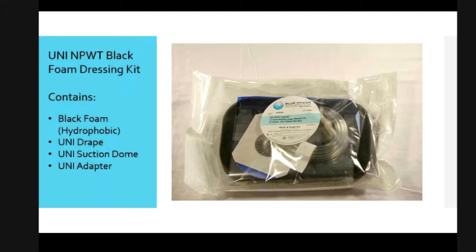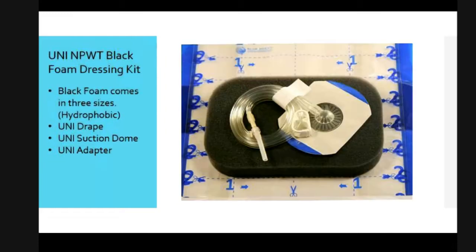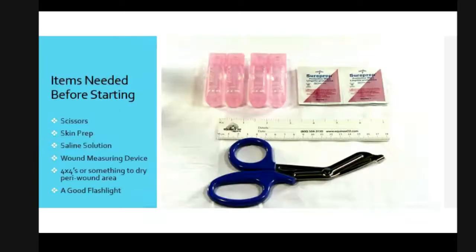So here we have the Uni Negative Pressure Black Foam Dressing Kit. It contains the black foam, the unidrate, the suction dome, and the adapter, which is already fitted on to make it easy. That black foam is hydrophobic, meaning it doesn't like water, and that's why it is such a good conduit to transfer any type of exudate through and out into the canister. Here it is opened — if you notice, there's a great luer lock system, so a nice tight fit. This is our dome, this is our black foam, and this is a very easy one-two-three drape. As a nurse, I absolutely love this drape — it works very well.